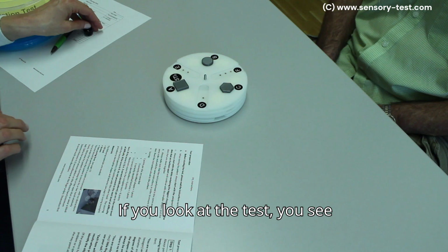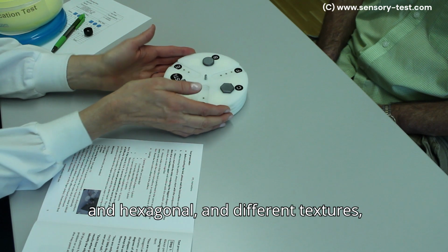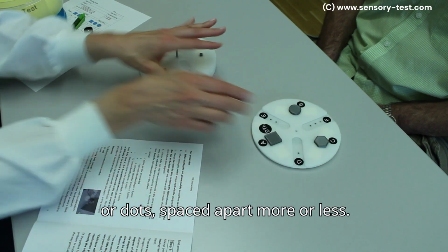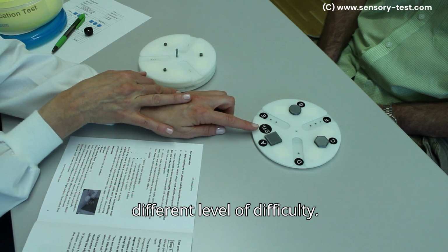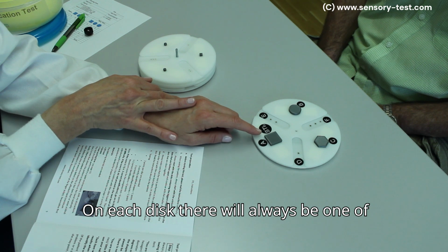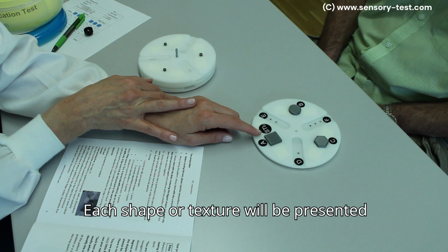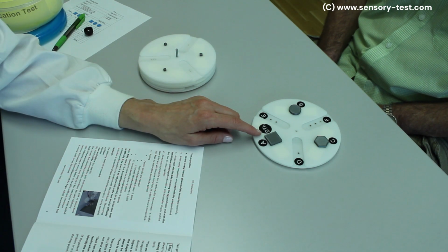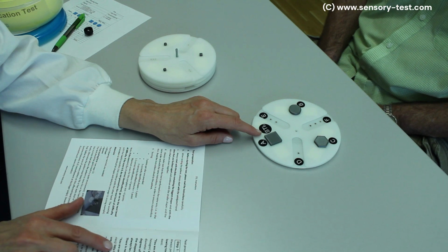If you look at the test, you see different shapes: square, round, and hexagonal, and different textures, or dots, spaced apart more or less. There are 3 discs, each with a different level of difficulty. On each disc there will always be one of each, whether shapes or textures. Each shape or texture will be presented to you in a random manner. There is no time limit. Take as much time as you need.